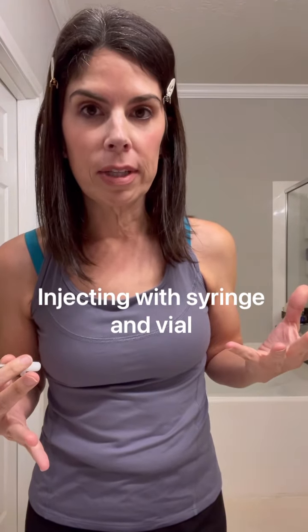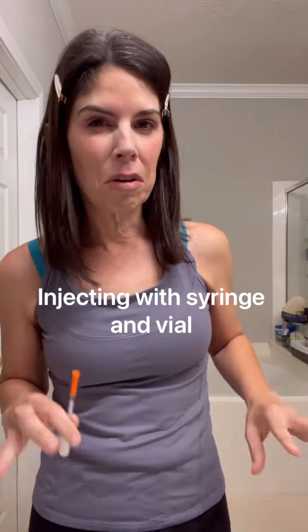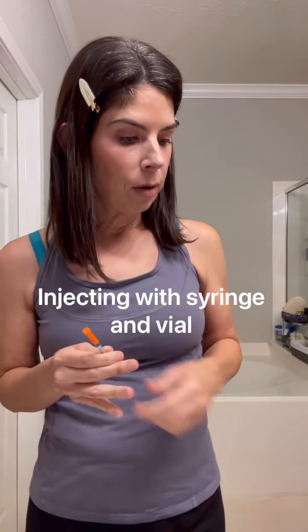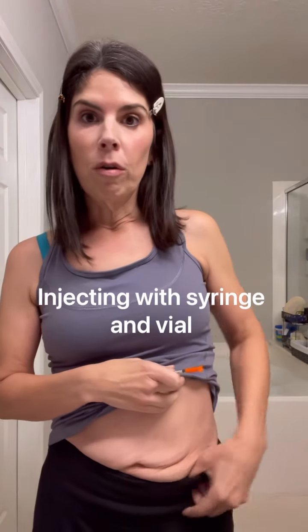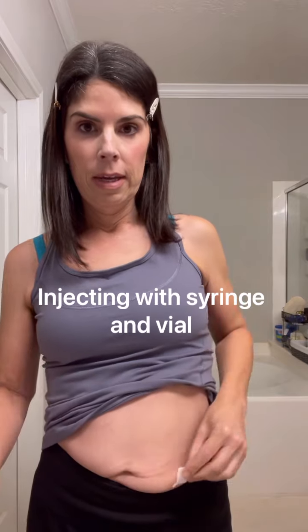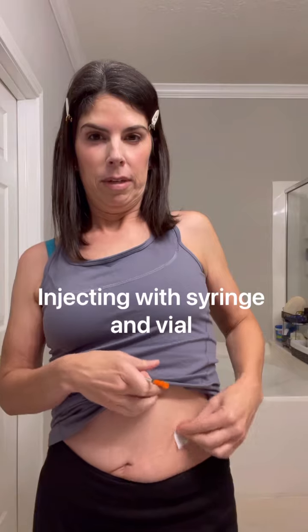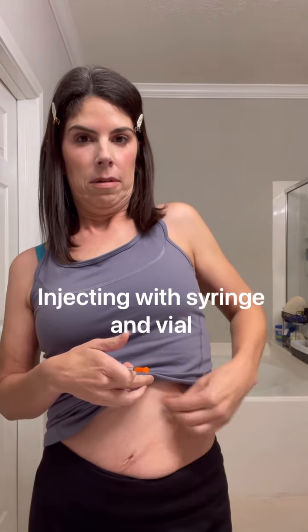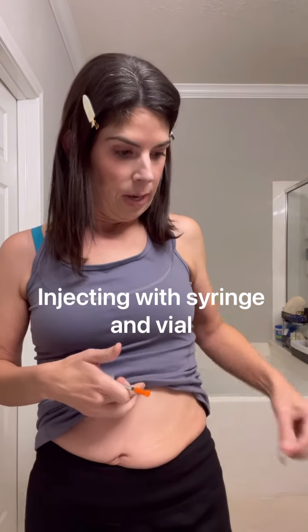Make sure your hands are already clean — I cleaned mine before this and put my hair back so I wouldn't touch it. You don't want to touch the needle or vial too much. Next, prepare your skin: use an alcohol pad and do a big circle on the side of your abdomen where you plan to inject. Let that dry.